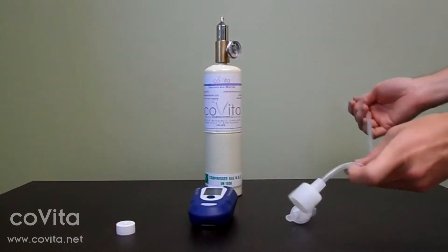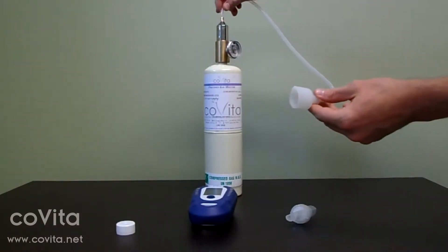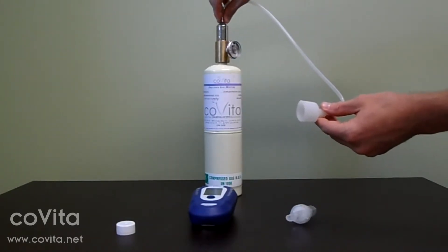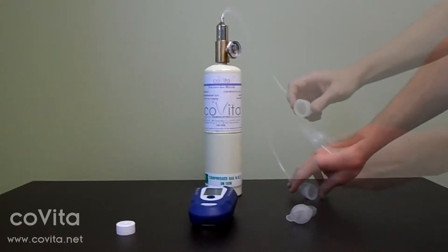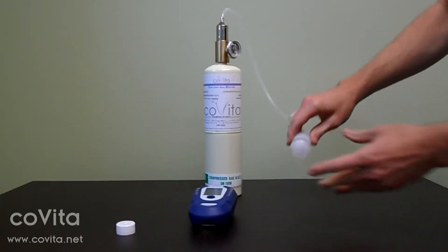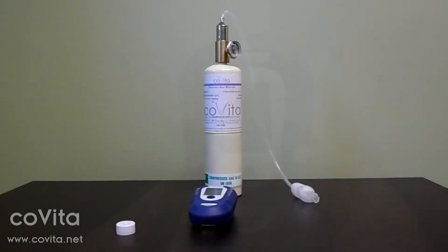Now, connect the small end of the calibration adapter to the top of the regulator. Connect the other end of the calibration adapter onto the D piece, just like you would a cardboard mouthpiece.